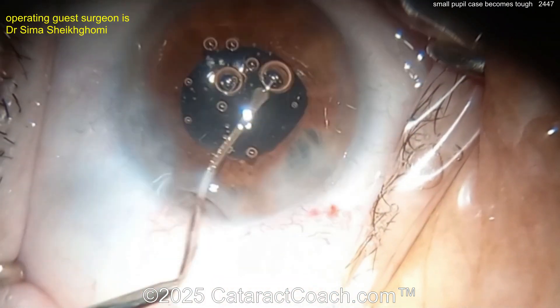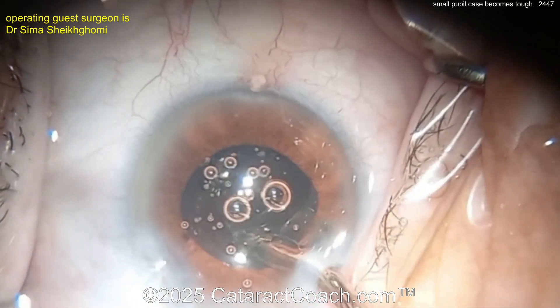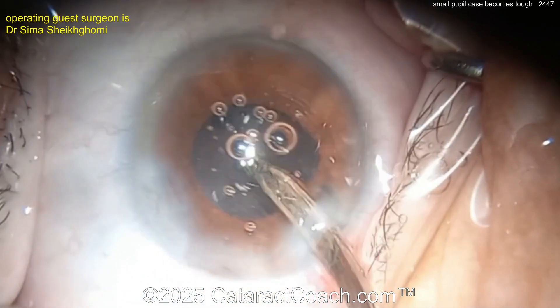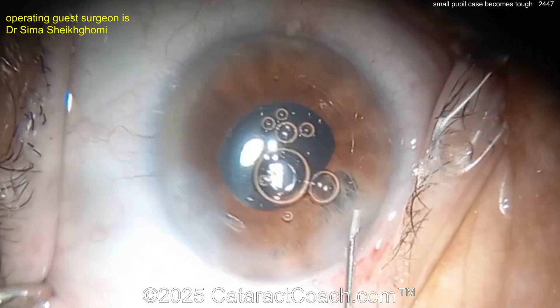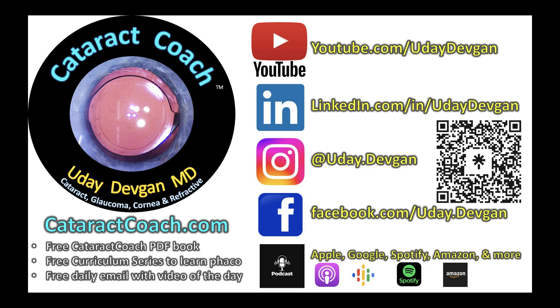Finish up this case and call it a day. Don't touch the iris — if you need to, you can always come back in a couple months and do a suture to close that iris defect. The patient is going to be happy. Beautiful case — thank you for sharing it. Remember to check out the Cataract Coach podcast, the top podcast in all of ophthalmology.